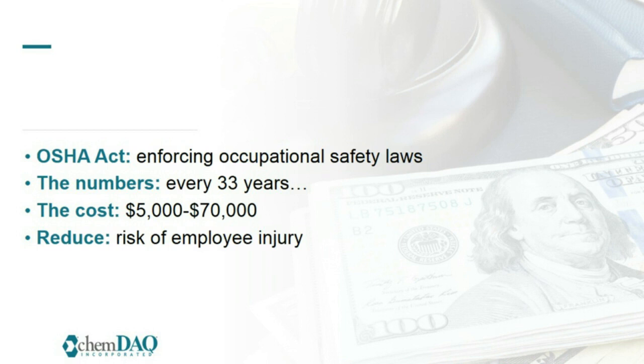So employers should take the steps to reduce the risk of employee injury by reviewing the workplace for safety and compliance, developing a written safety plan and policies and procedures around 29 CFR 1910.39 and the HAZCOM plan 1910.1200. And they should be ensuring that the necessary equipment is available and employees have been trained how to use it. And they should also be performing regular inspections.